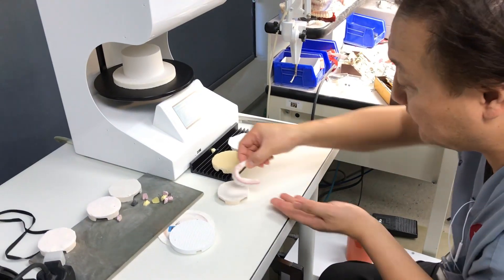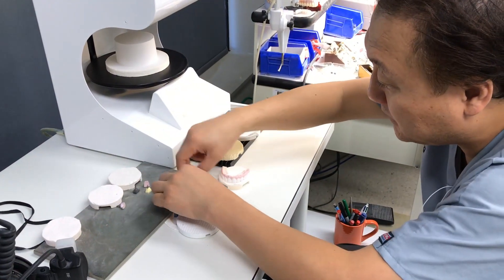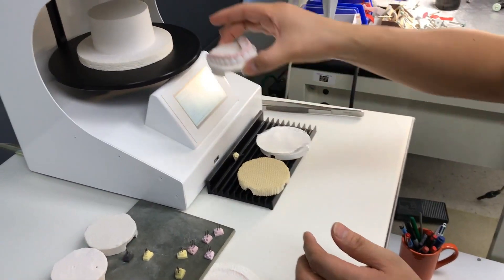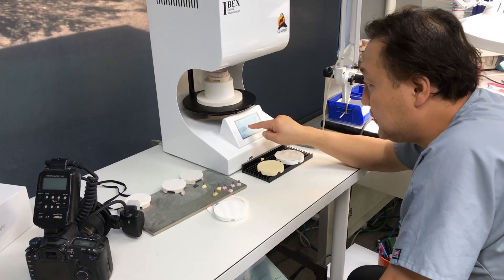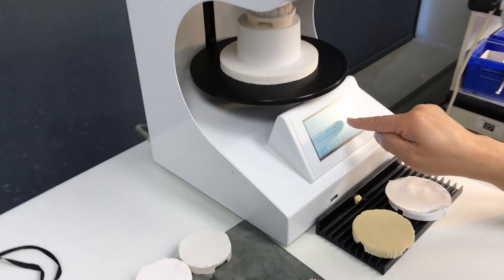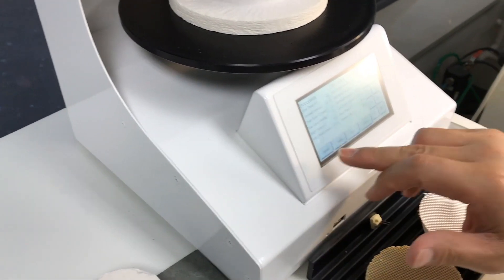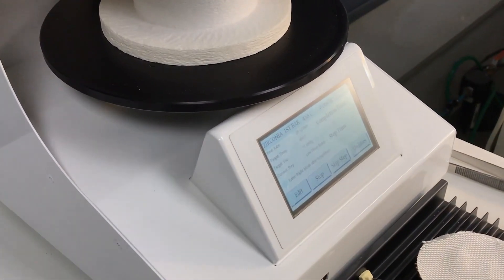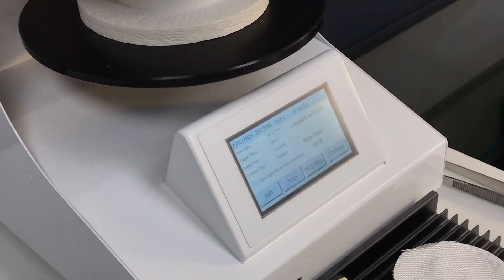This is a pillow top type — so I can put the pillow area like that. Or you can use this. Let's put it in there. Zirconia — first bake here. Preheat time: 6 minutes. Cooling time: 25 minutes, which is very important. Temperature: 810 to 820, depending on the porcelain. After I check it, then I fire it. It takes about one hour because of the cooling time.